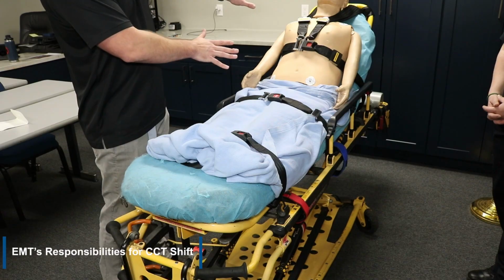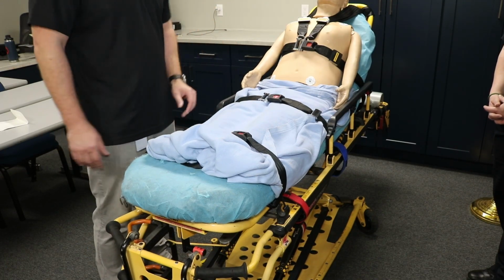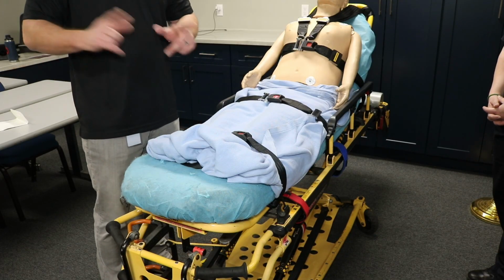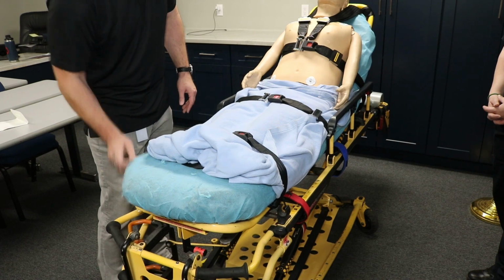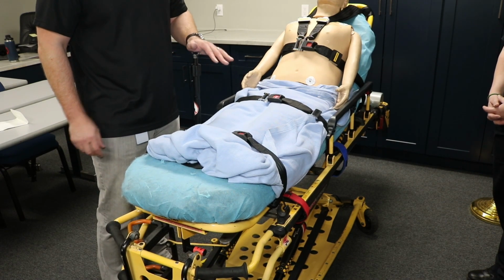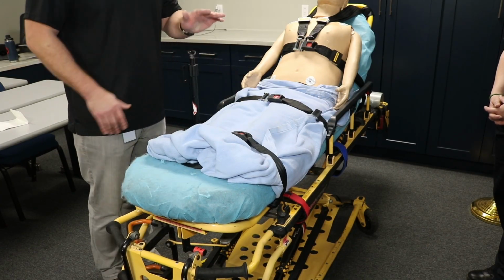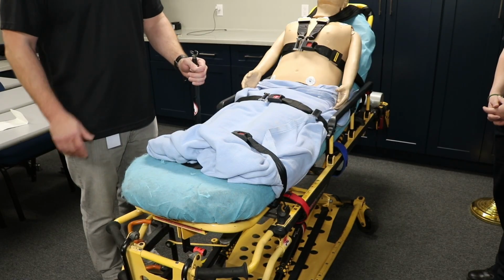After we've already got the patient loaded up on the gurney, attached with multiple points of securement with the seat belts, we're going to add the tray on now. First thing we want to do is lift up these IV poles into position. Some gurneys will have two, one on each side. This one only has one, so make sure it is secured here.